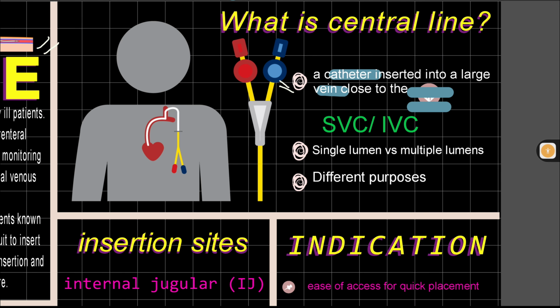Oh, sorry. Close to your heart. Now, you might be mistaken, but there are two large veins in the heart where the tip of the central line will normally be terminating, kung saan siya magtatapos.